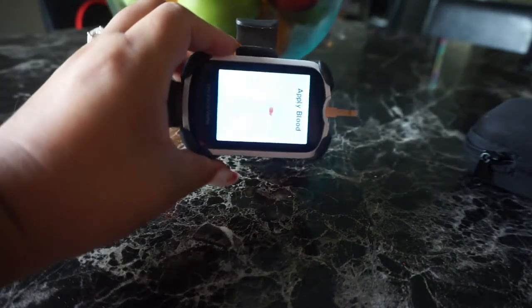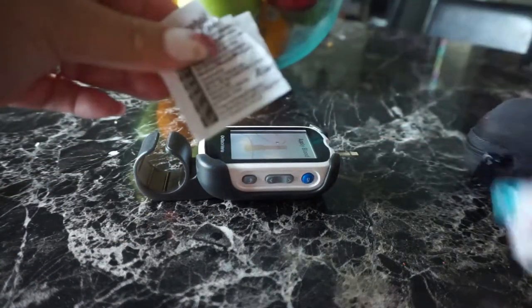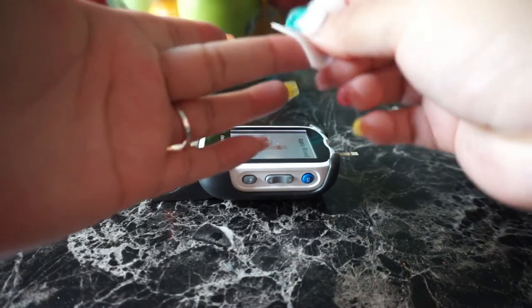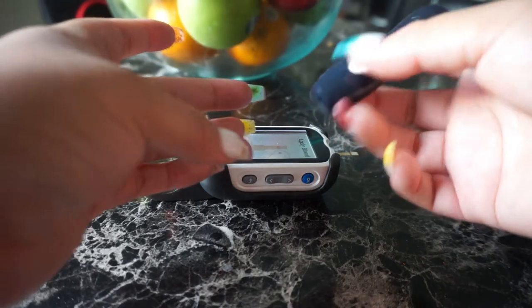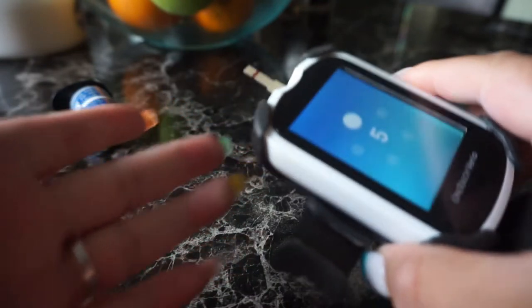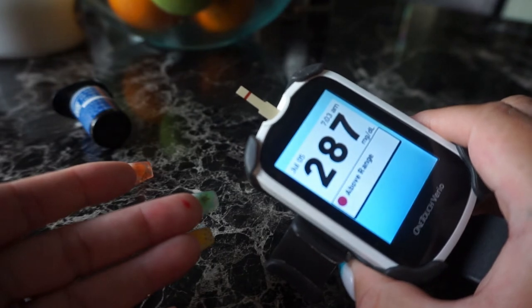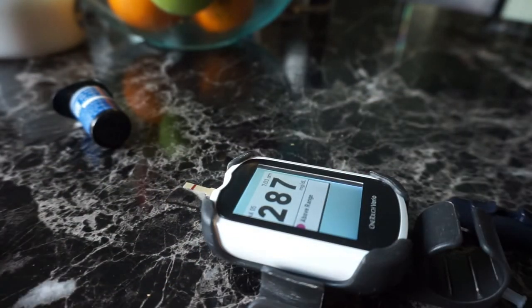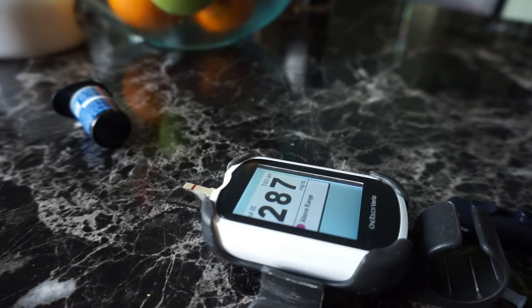I set it down and grab my strips. To turn this on I just push the strip in like that and it turns on. It's gonna tell me to apply blood. I grab my alcohol and put some on my finger, then press this little white part and put the blood in there.